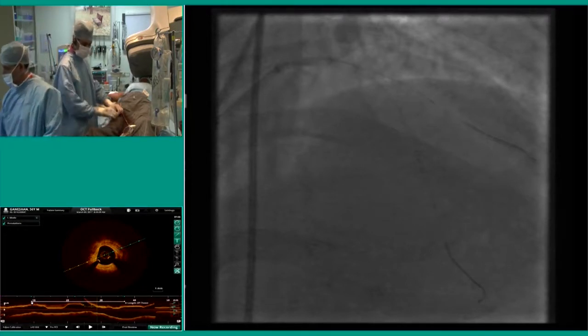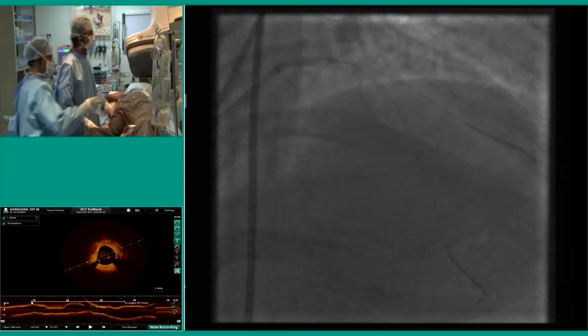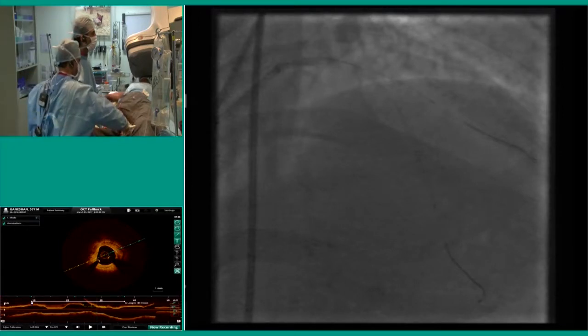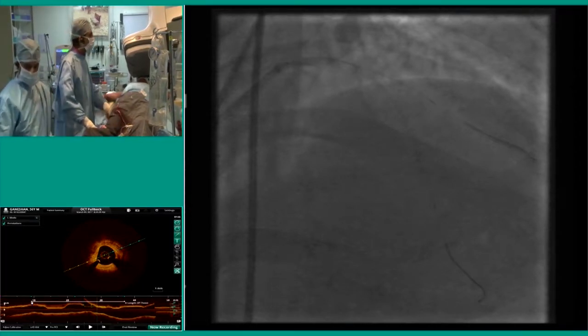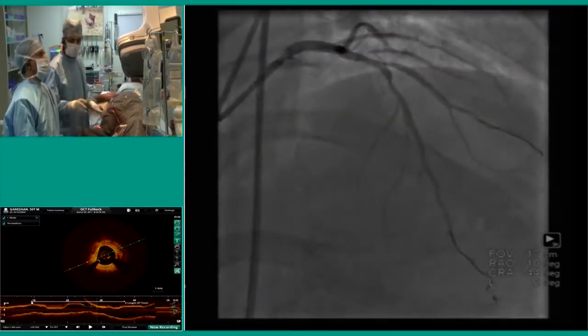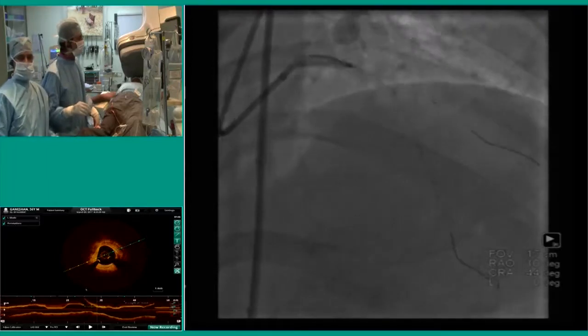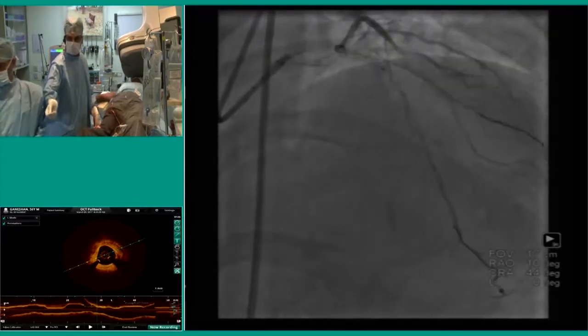The panel agrees, or should we take 3? We have quarter sizes, 2.75 may be better even. Proximal LAD may be very less in size. No, that is the reason I am taking a Synergy stent. I am going to blow it up to nearly 4. With 3.5, I will do a POT, and then we will look at OCT.